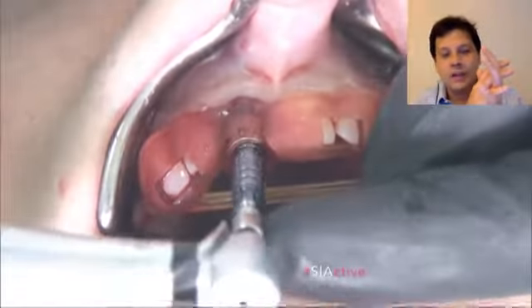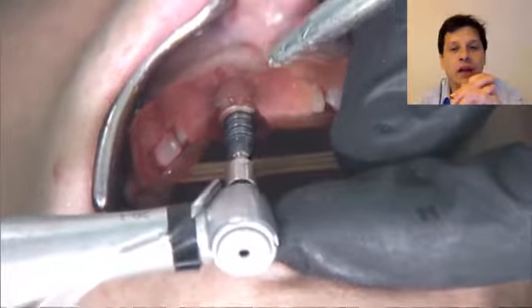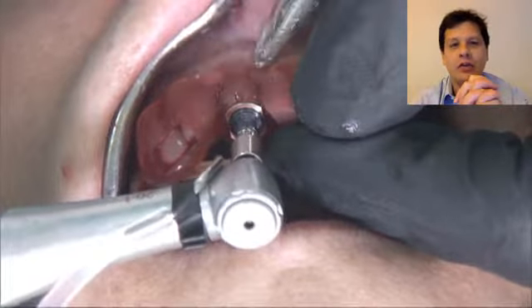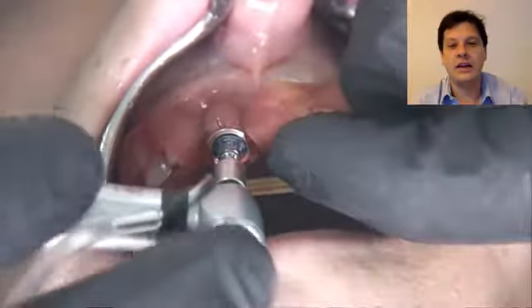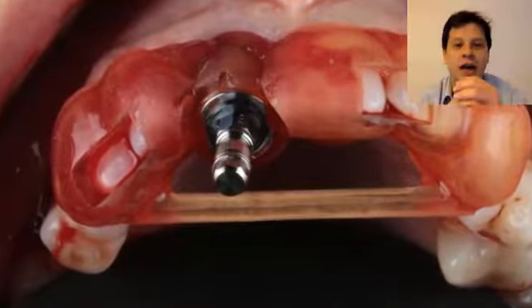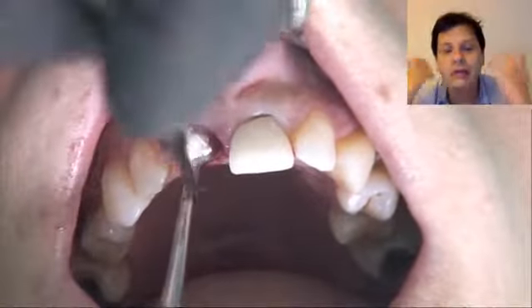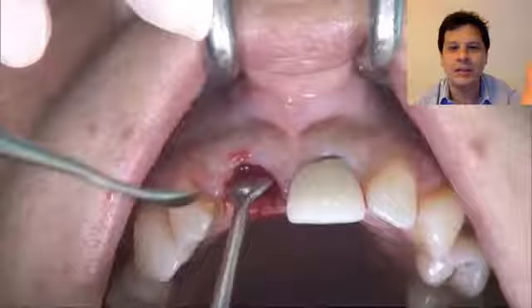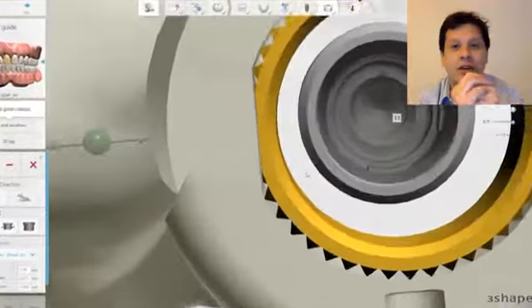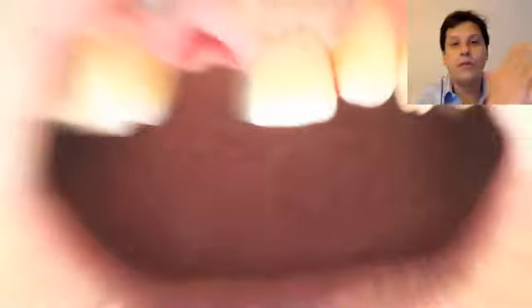So the thing that you are going to see is that this is a fully digital protocol from Straumann. This is a totally guided situation where the implant goes in according to plan. So it reaches the end and it's in. Now you just have to take out the abutment, take out the surgical guide, and then you place your final restoration. Of course, you don't have to forget that you're dealing with immediate implants. You still have to graft that buccal bone. You have to go to the literature. That's another separate discussion. But what we now have prepared is the provisional restoration beforehand.